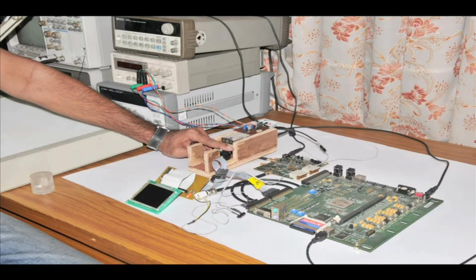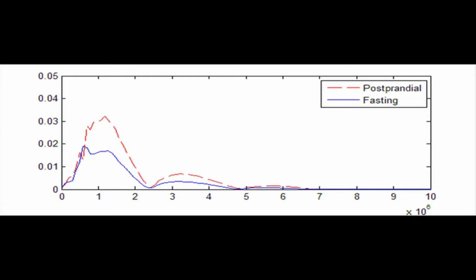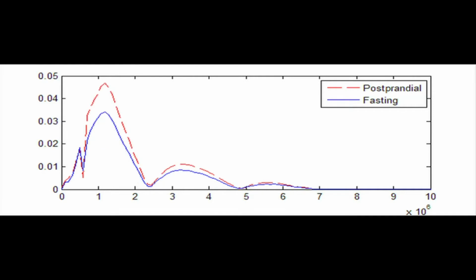Following in vitro measurements, in vivo measurements were performed on a set of individuals suffering from diabetes. 2 blood glucose measurements were taken, one fasting measurement and another postprandial. The photoacoustic measurements again followed the same trend shown by blood glucose concentration of the individuals.